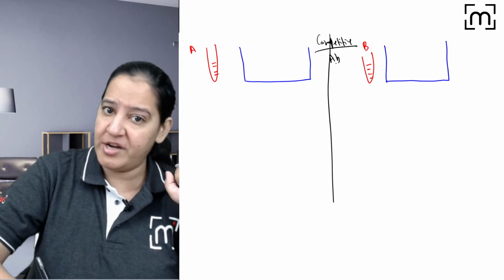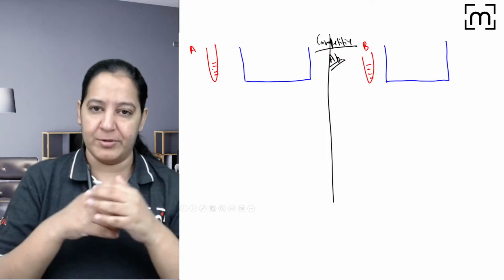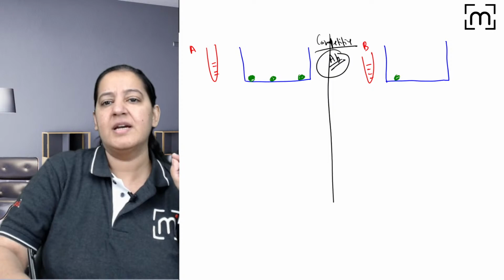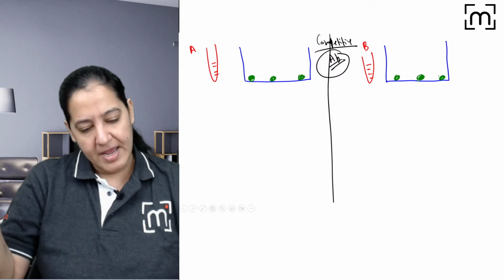So step one starts with the opposite. You want to test antibody, no? Start with antigen. Why don't you start with antigen? So start with antigen. Take HIV antigen here also. It is available in the market. Again and again I am saying, take HIV antigen here also, right? That is step one done. Now in step two, what will you do, you tell me. You will add your patient sample.